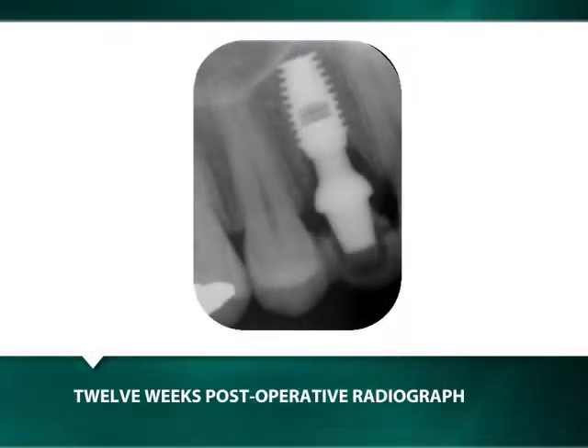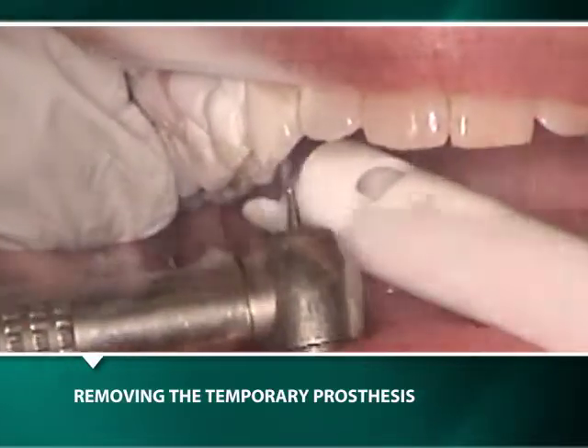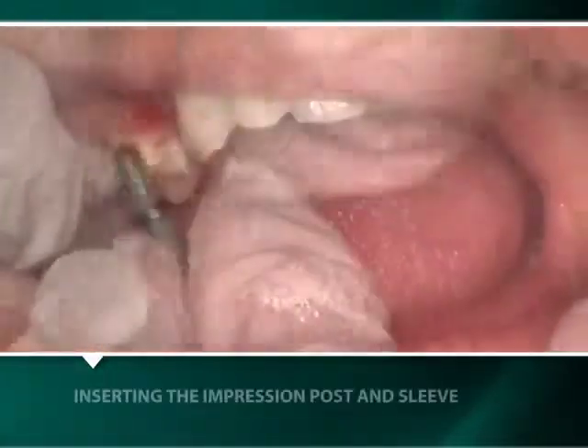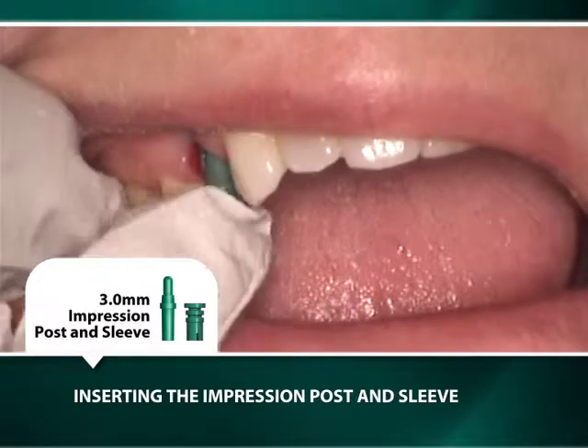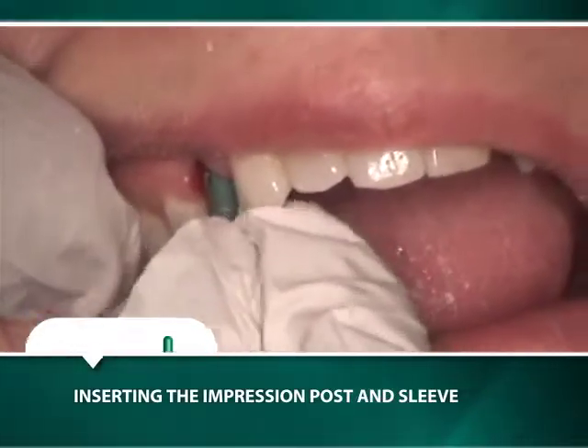Twelve weeks later, during the second clinical visit, the bonded transitional crown is removed. The titanium 5mm by 4mm zero-degree shoulder abutment is replaced with a green impression post in its corresponding acrylic sleeve for the making of a full-arch implant-level transfer impression.